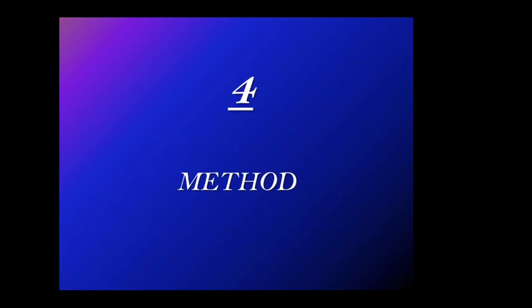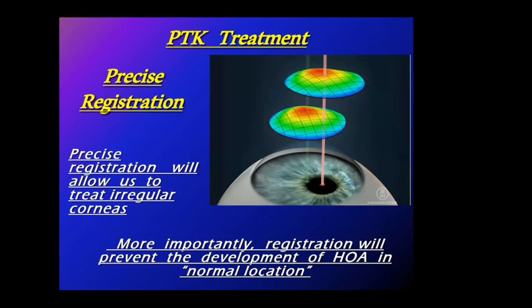Dr. Sami, may I ask you, please, when you say wavefront here, do you mean the ocular wavefront? Yes, because topography is not a wavefront. Exactly.